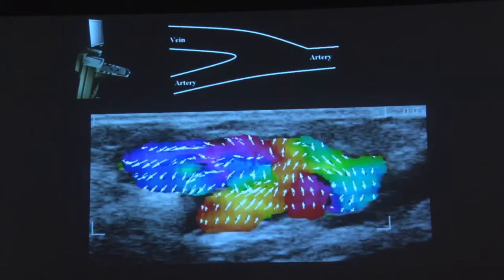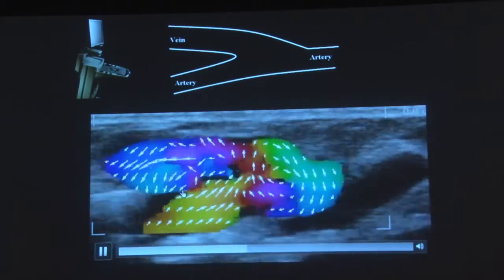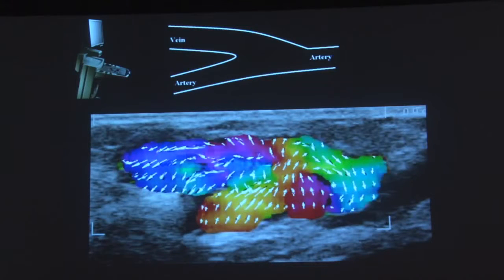And the flow here, and so I have a colleague who's a medical doctor and a PhD student. He's trying to look here in the arterialized vein and see if he can use this 2D vector flow information to give quantitative data of the volume flow. He of course has to make an assumption of circular symmetry because he doesn't have the out-of-plane component, right? So that's where 3D will come into the picture.